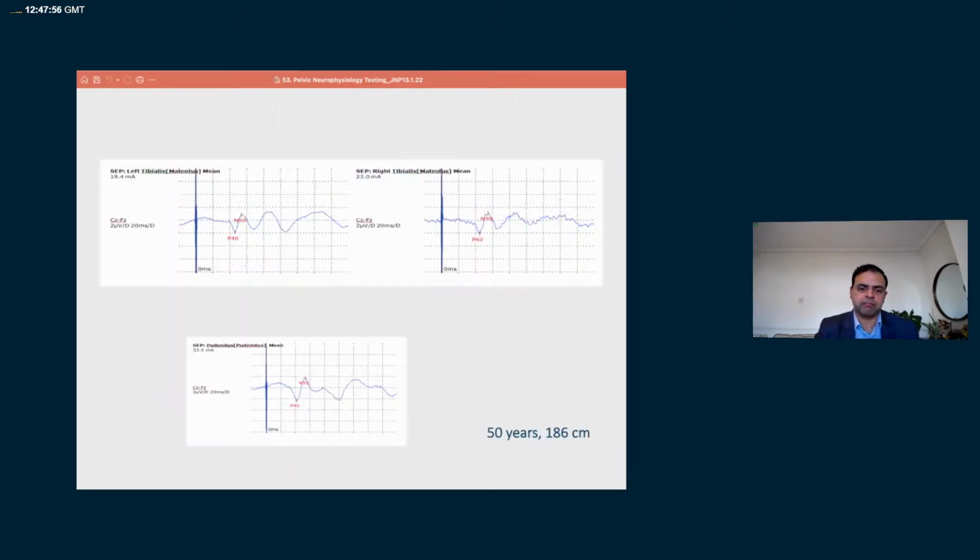or conus lesions. Those of you familiar with SEPs will recognize this W-shaped pattern. This W is the normal morphology of the tibial sensory evoked potential, and one looks at the first downward deflection, which occurs roughly 40 milliseconds afterwards, and hence it's called the P40 response. You'll see that in this male patient, when the dorsal penile nerve was stimulated, you have a similar W-shaped pattern, similar latency, and we also look at the P40 response.